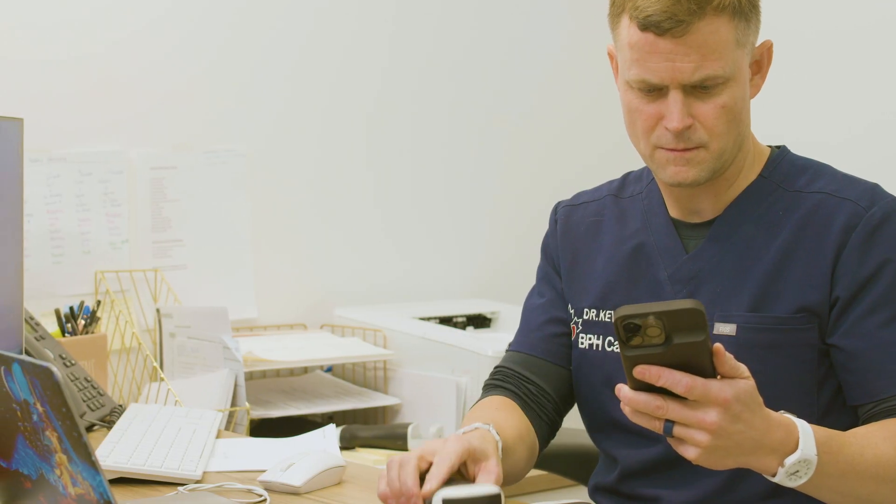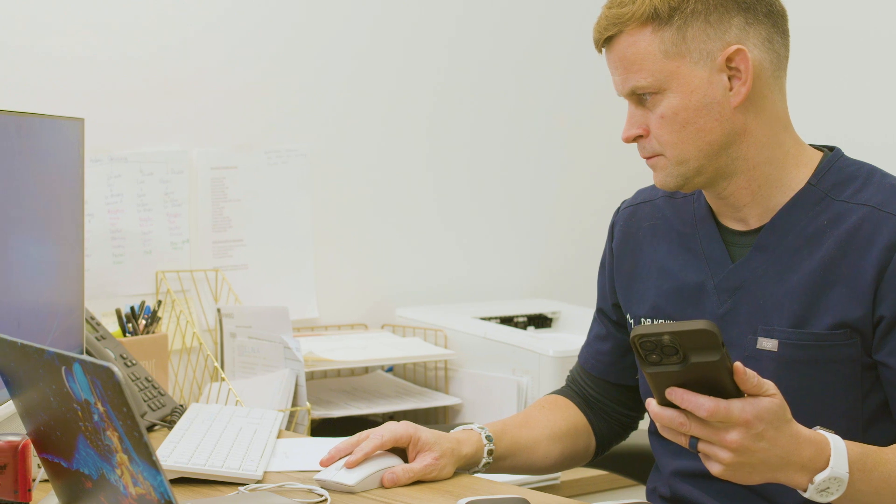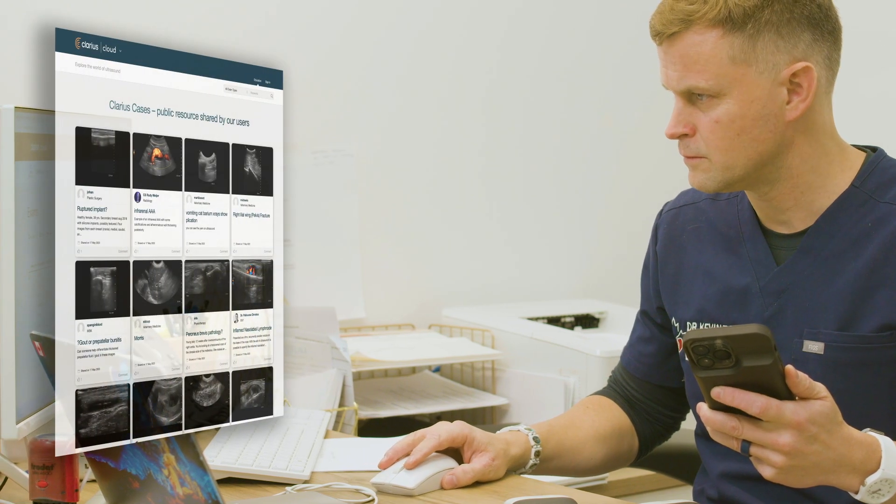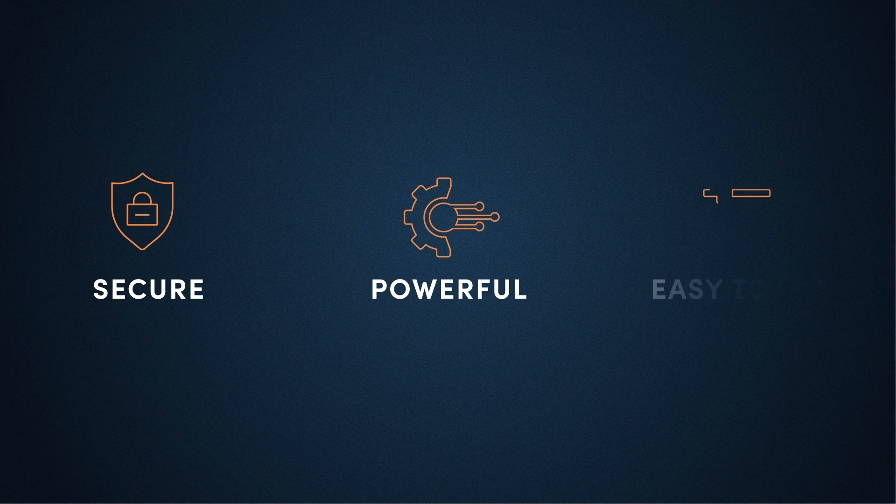Clarius Cloud allows you to manage images and exams captured with your Clarius ultrasound scanners. It is designed to be secure, powerful, and easy to use.